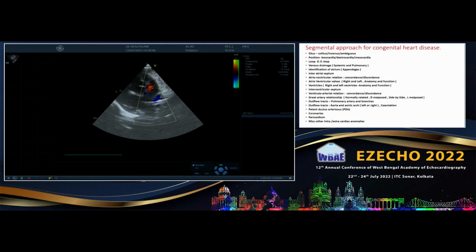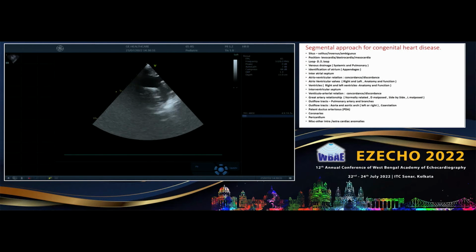The saturation could have helped us to know at the beginning. It was 70, so 70% saturating, and there we are expecting, because she is showing a flow, the branch pulmonary artery she is showing small. If you can show from the arch view, the peculiarity of tetralogy pulmonary atresia, we frequently have a PDA from the undersurface of the arch or more proximal, having a tortuous course. So yes, she is showing.